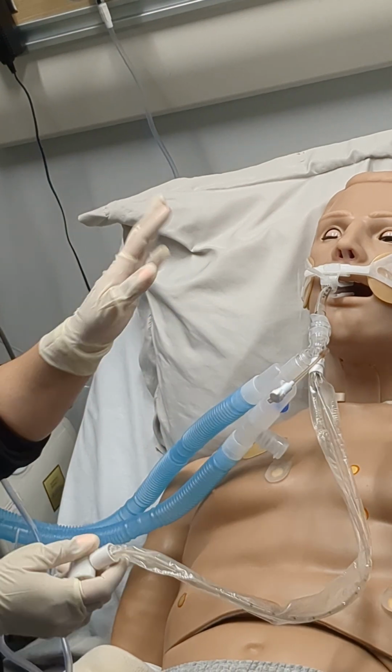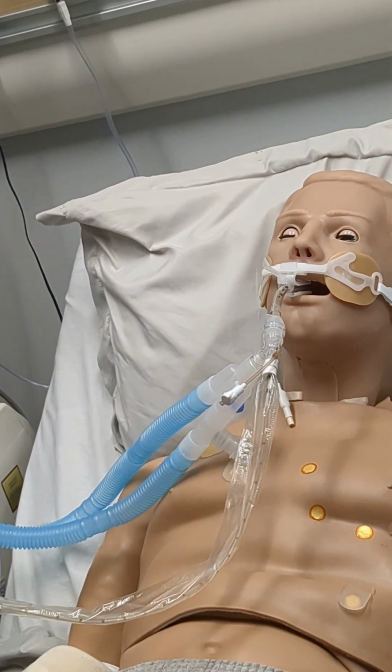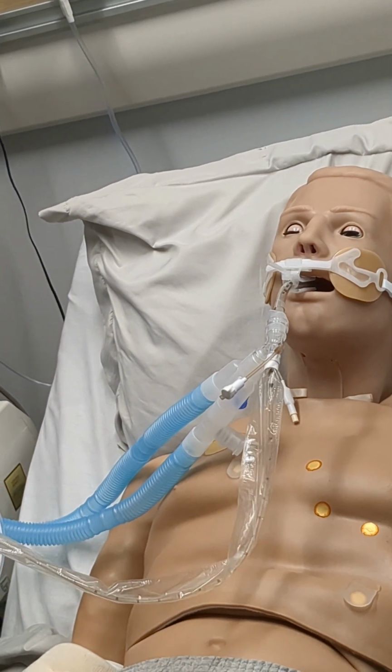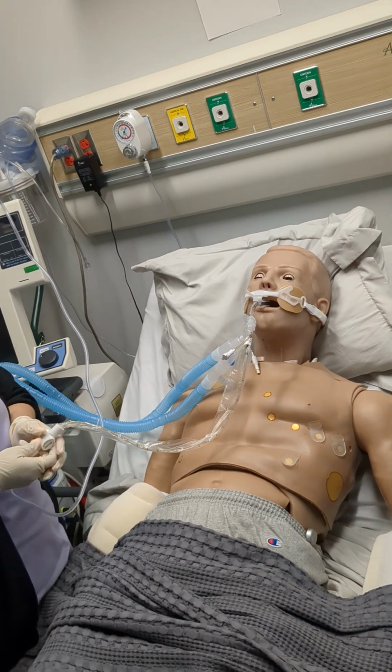Are we gonna need to flush as well? Continue hyperoxygenating. I don't think so. She didn't say that. You just flush after you're totally finished. Completely finished, okay. Sometimes I may have to do it before, but usually no.